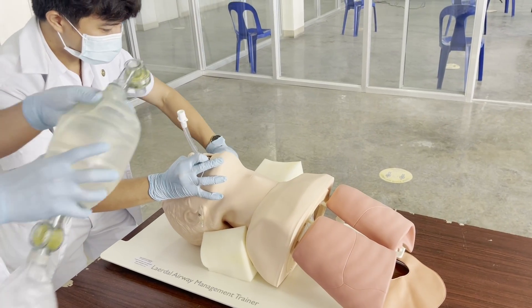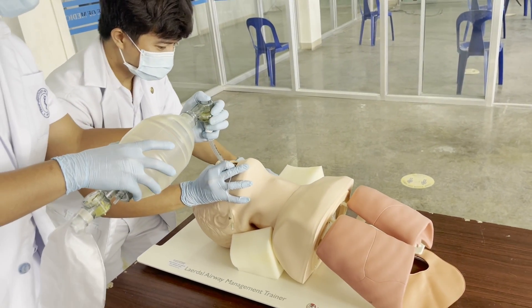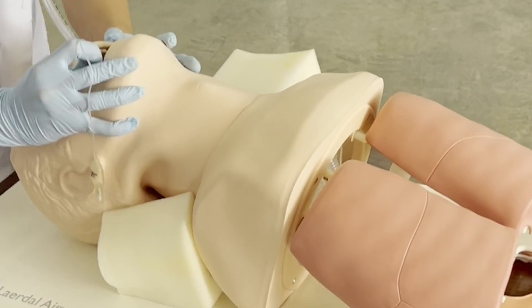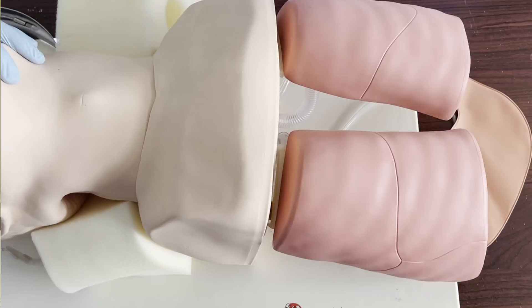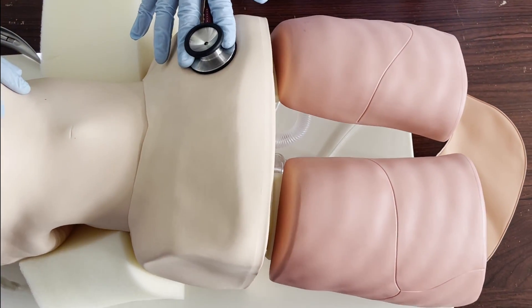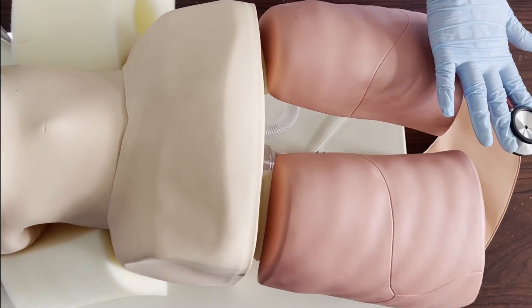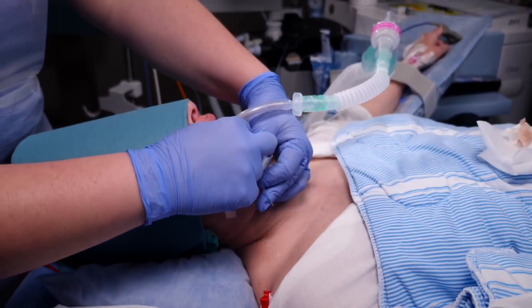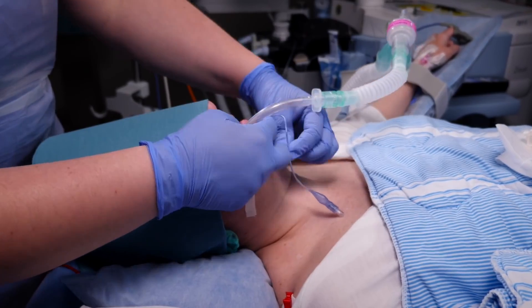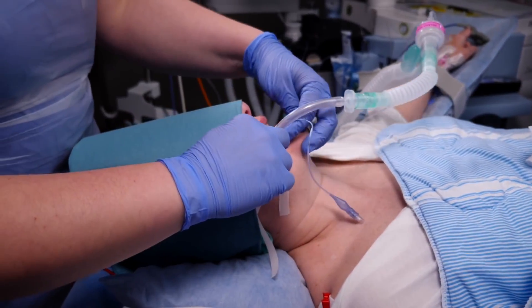Attach the tube to a bag valve mask resuscitator for oxygen. Check for chest expansion. Evaluate the placement of the tube by auscultating the chest as well as the epigastrium. Equal breath sounds must be heard over both lung fields. Once correct positioning of the tube has been confirmed, connect the tube to a mechanical ventilator and plaster the tube in place.